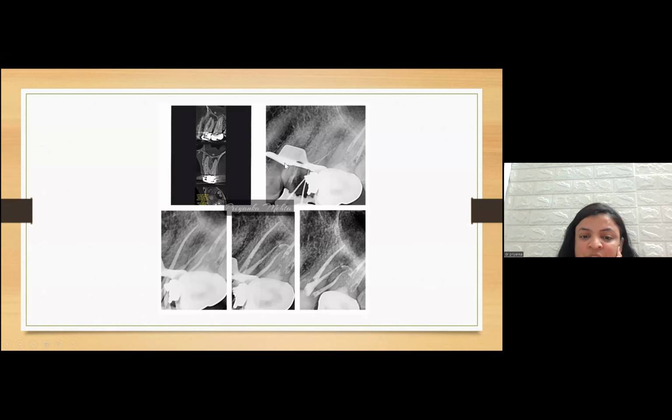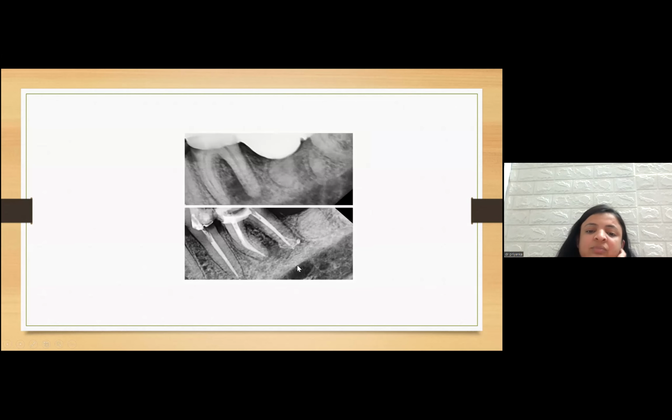There were a few ledge formations, negotiated them as well. Cleaned, disinfected, kept calcium hydroxide for a week, and then filled it up with bioceramic and GP points.